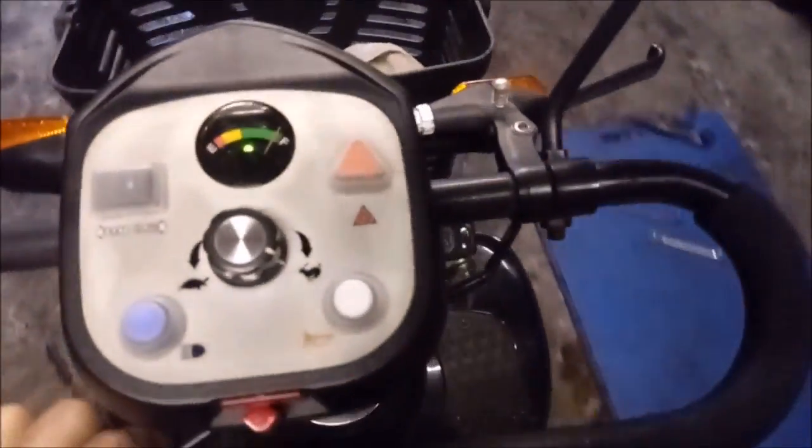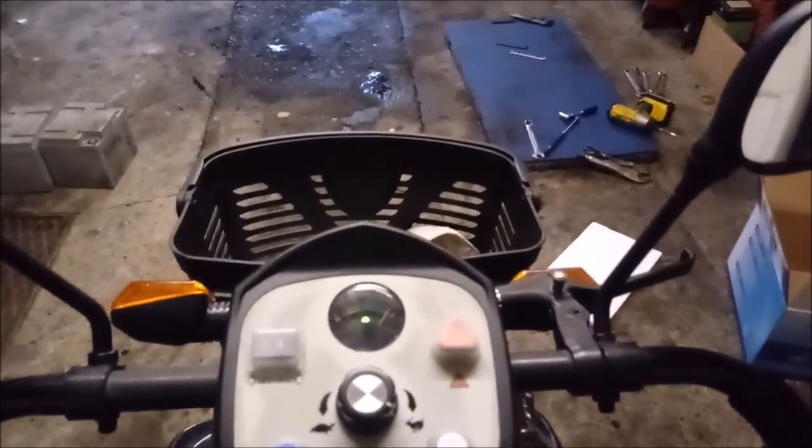Right, that should do them, I think. Mind the garage door. Right, full speed forwards. Whoa, yeah, that goes pretty well, I think. I think you'd be happy with that.